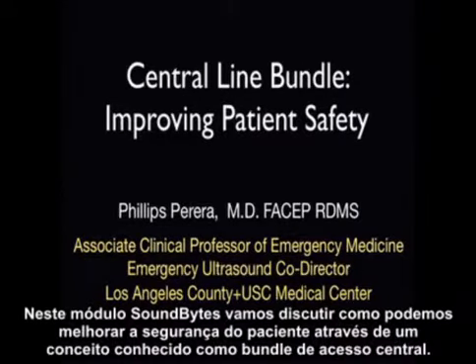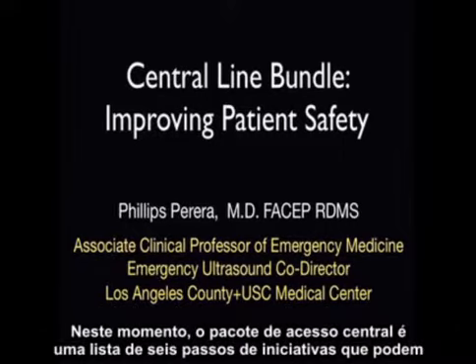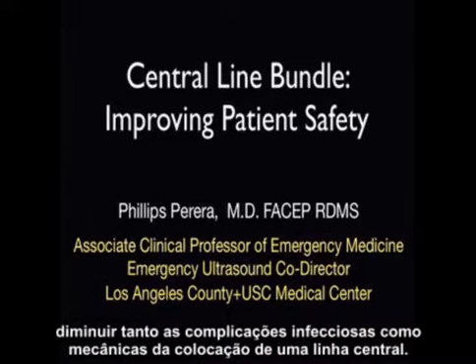In this Soundbites module, we'll discuss how we can improve patient safety through a concept known as a central line bundle. Now, the central line bundle is a 6-step checklist of initiatives that can decrease both the infectious and mechanical complications of central line placement.